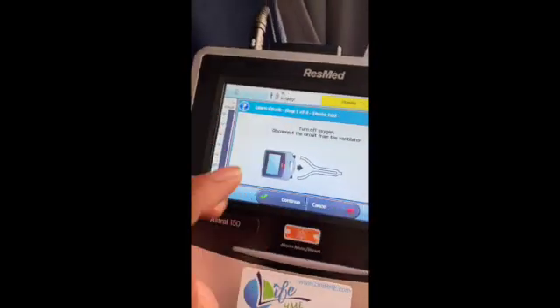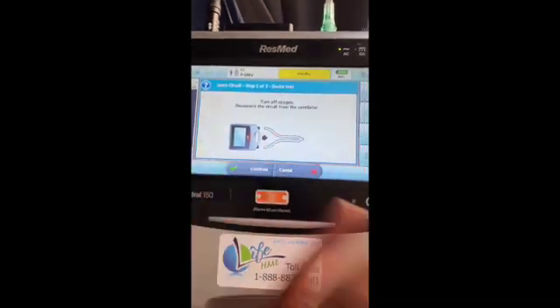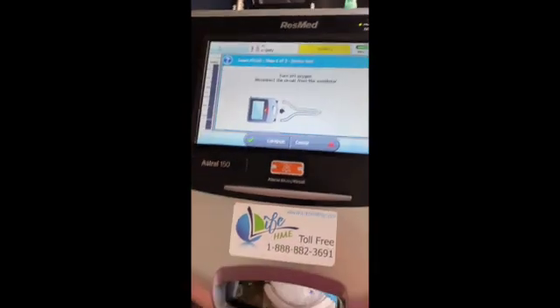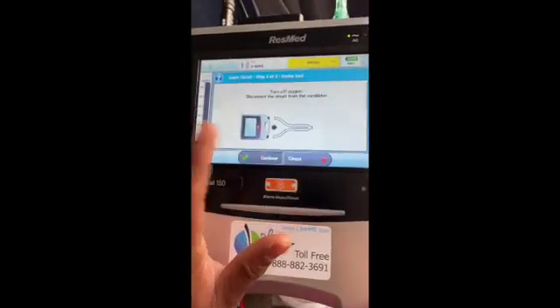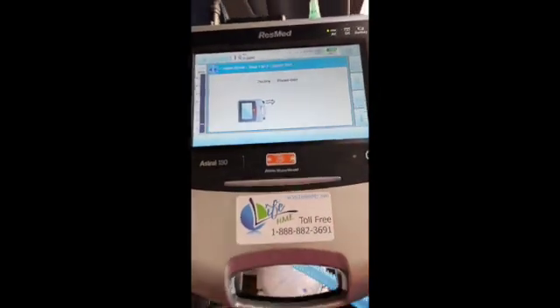You want to press 'Start.' This is Step 1 — it has three steps and it's very easy. The vent will tell you what to do step by step. It tells you: turn off the oxygen (which is off because Braylon is not connected to oxygen), and disconnect the circuit from the ventilator, which I've already done. So you're going to press 'Continue.' Right now it is testing the ventilator.